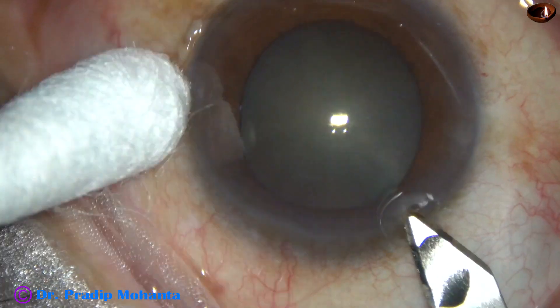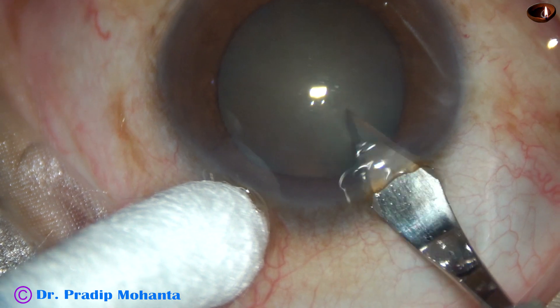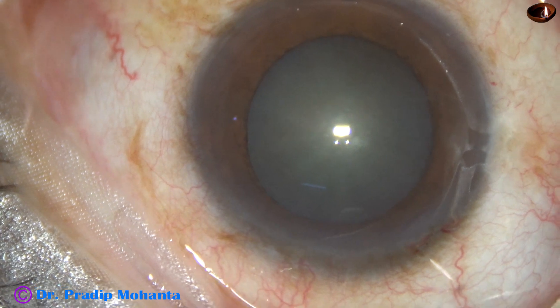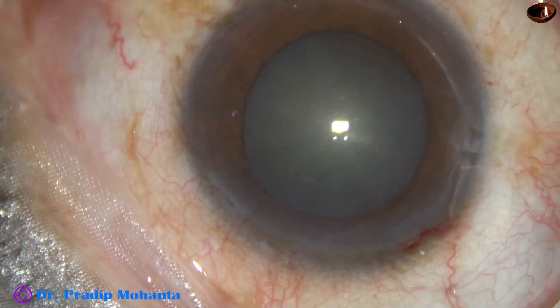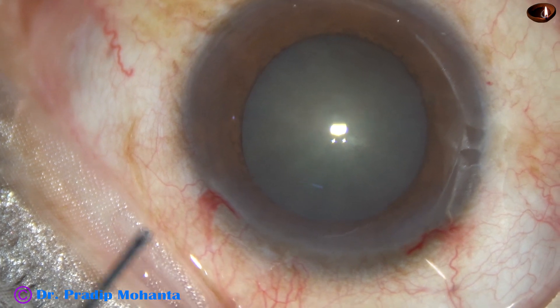This is the main incision at around 11 o'clock with a 2.8 mm steel keratome on the posterior aspect of the limbus. This is a side port about 2.5 hours away from the main incision on the left side.